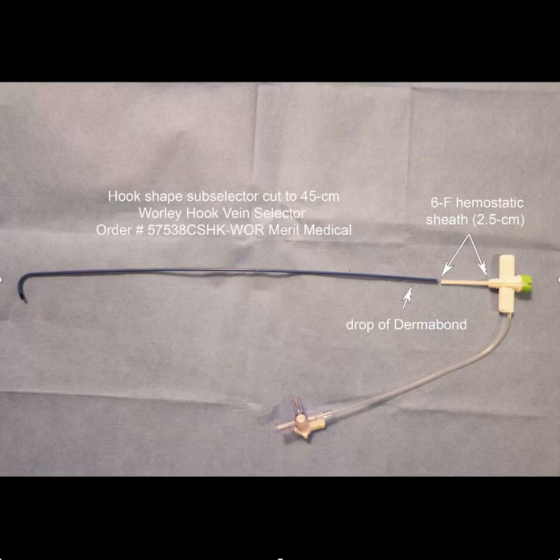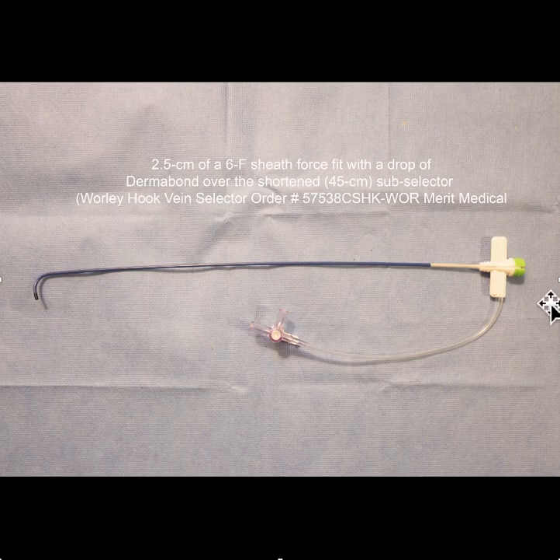What you would end up with would be something that looked like this — you now have the hemostatic properties preserved in a shorter version. There are four different shapes of the lateral vein introducers. I don't know what shape would work best; I'm thinking the hook might, but there's also the renal and the hockey stick that you could try.